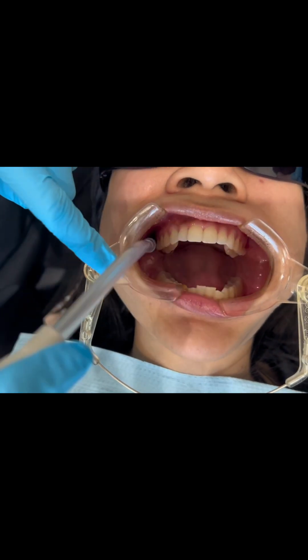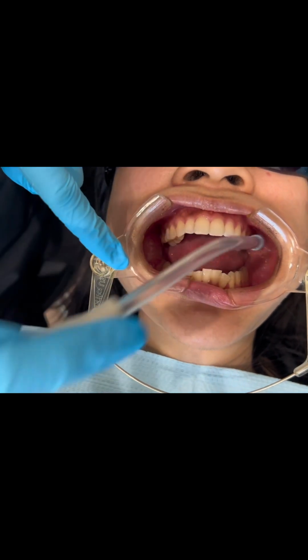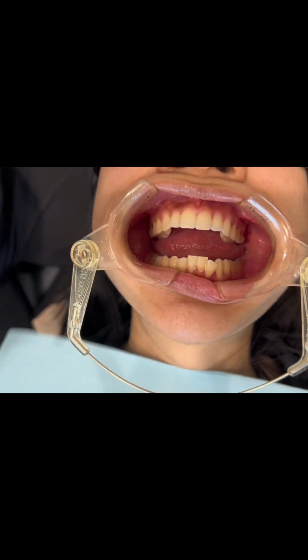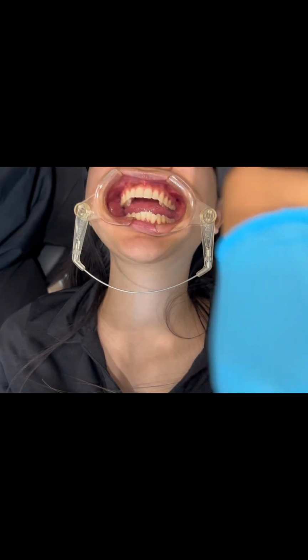All right, and open big. I get back here, under the tongue, everywhere. And if it did get on her, I'm very comfortable with this patient. Sorry, Katie. Okay, don't do that to your patient.